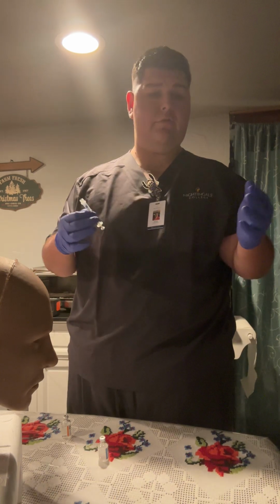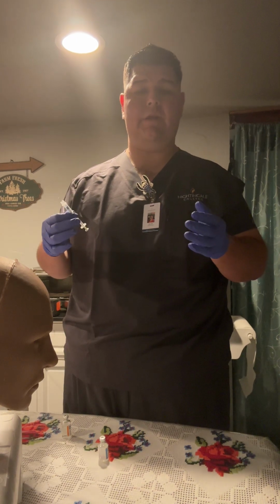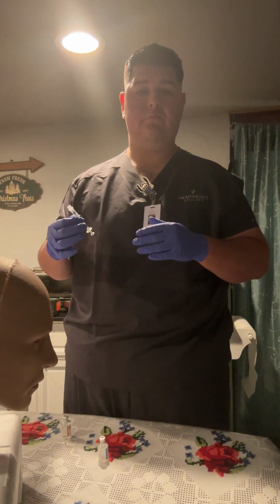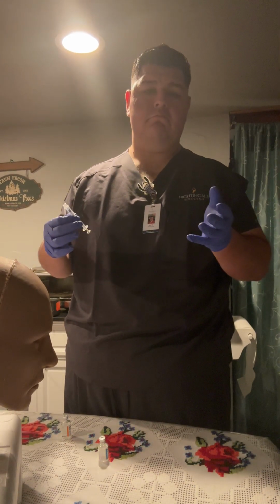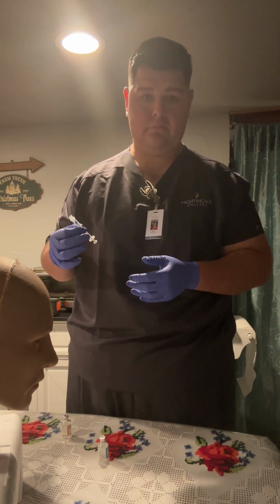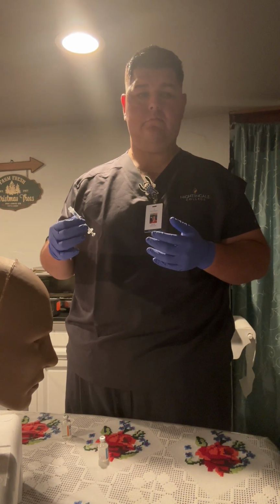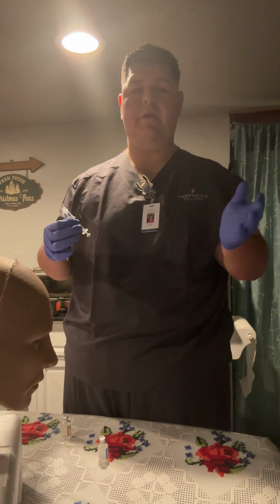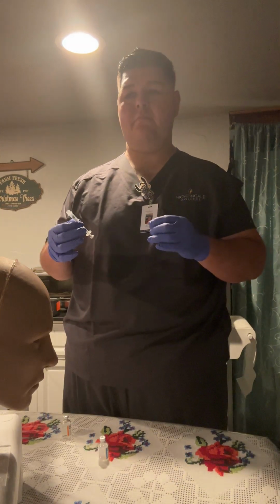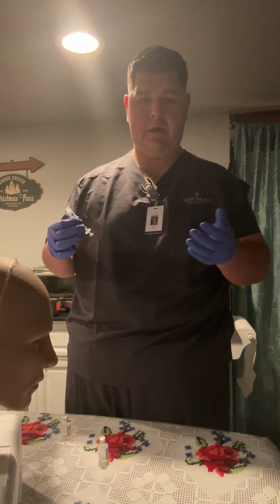Okay, so I had 4. My total dose of insulin needs to be 12. So I drew up 8 units of my NPH. So, okay, total 12, and my nurse and I will verify that with the MAR. I already withdrew my needle from the vial. I tapped on the syringe the first time around. Like I said, I didn't see any bubbles the second time, but if need be, I can tap on the syringe to ensure the air bubbles are taken out.